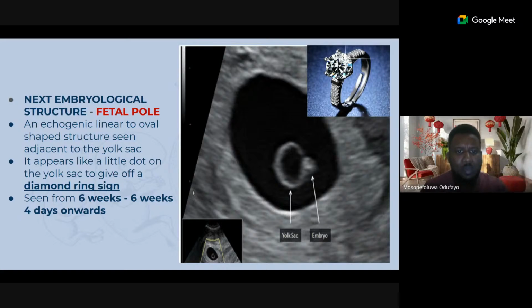Then the next thing that happens is on that yolk sac, we now begin to have a particular area that is non-uniform, a particular non-uniform thickening on the yolk sac. That is the beginning of every single individual that is watching me in this particular webinar today. You started as this.